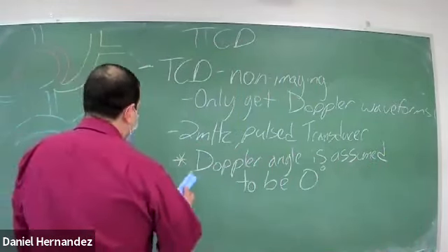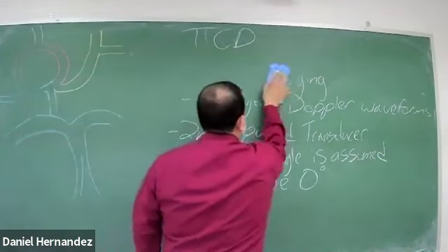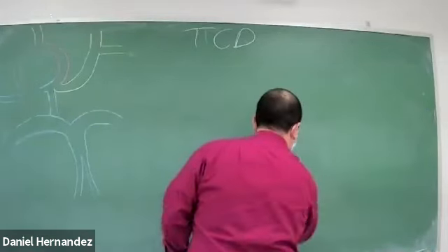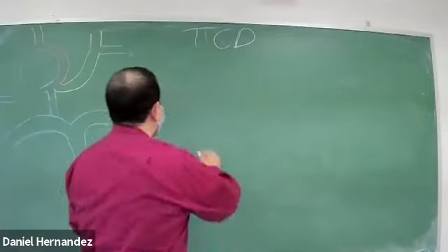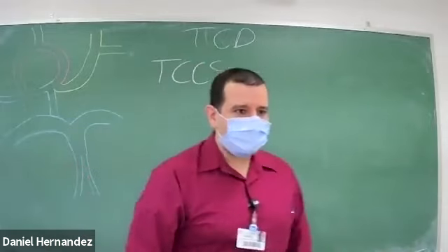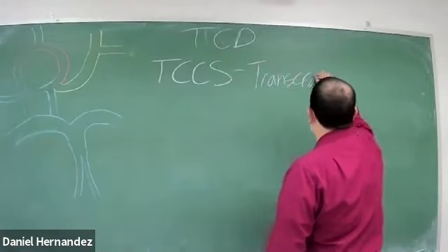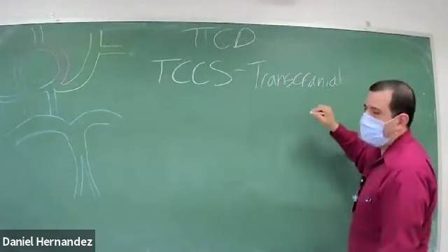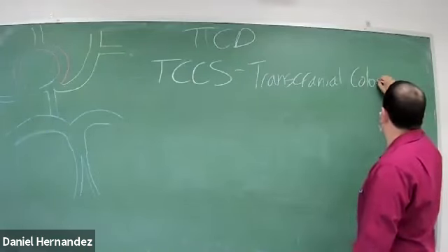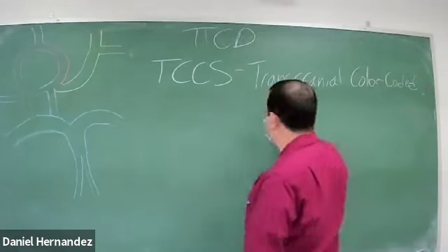This is the more modern transcranial Doppler that we do, called TCCS, color-coded sonography.